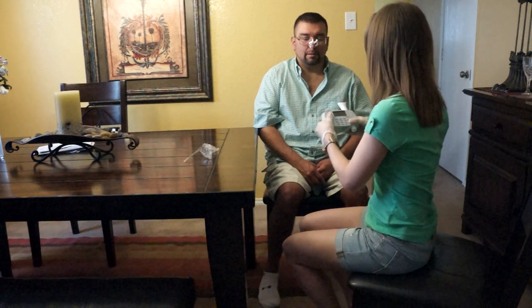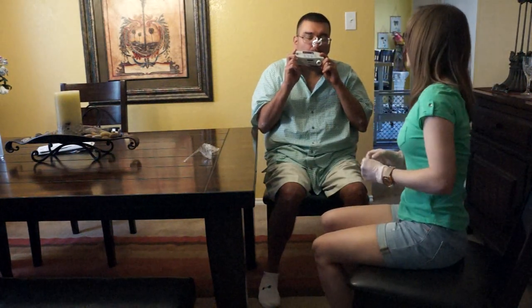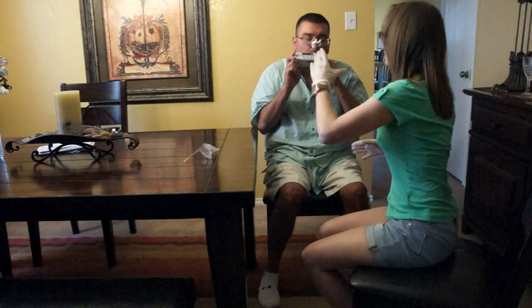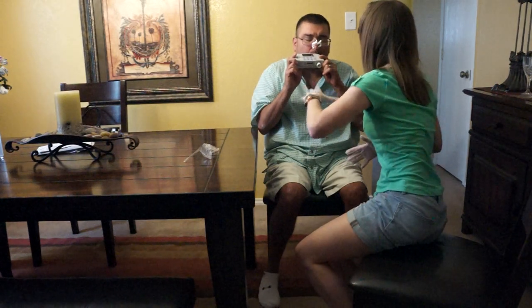Okay, are you ready? All right. Okay, big deep breath in. Good tight seal, tongue underneath, blast out, hard and fast. Go. Keep going. It's okay, cough through it. Keep going. Go. Big deep breath in.